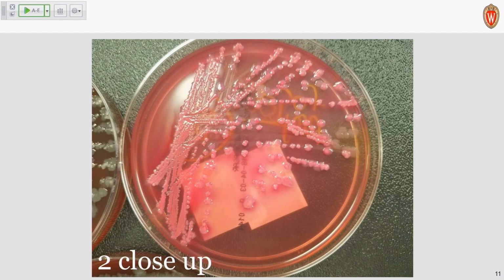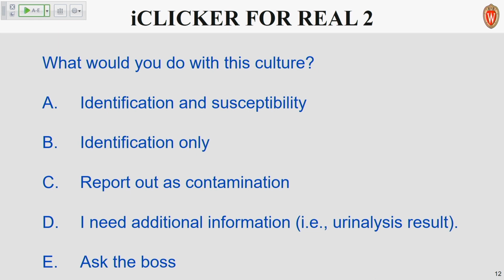What would you do with this one? ID and susceptibility, ID only, contamination, I want more information, or again, ask for help. What kind of a catheter was that again, Heather? Indwelling catheter. Okay, from urology. Thank you.